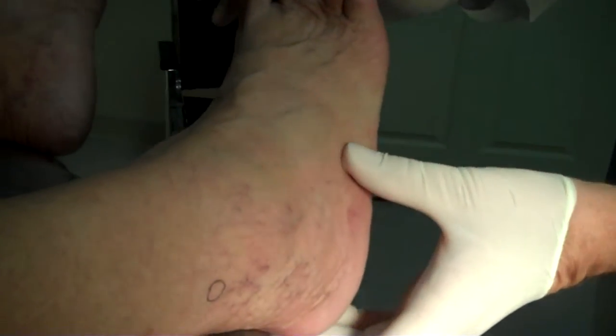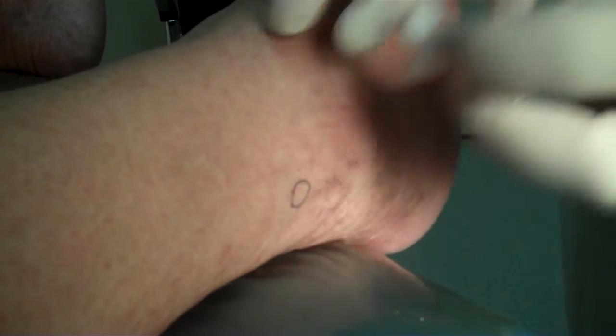Just a couple of things about this that are a little different than other biopsies. It's a 3mm biopsy punch, so we keep it standard — keep it the same in everybody.